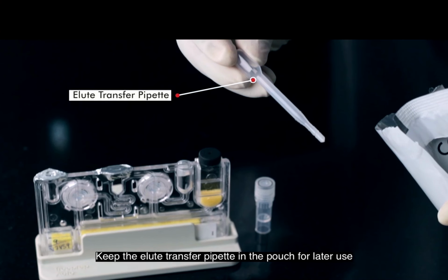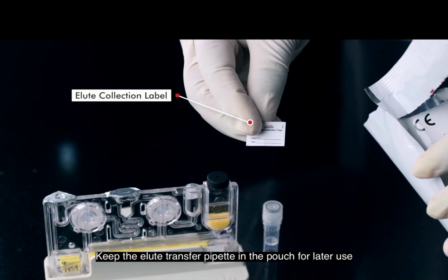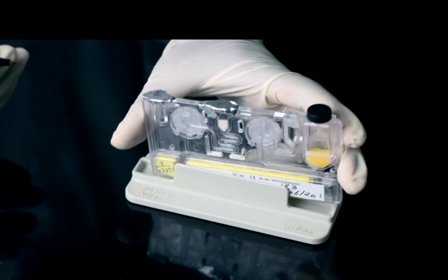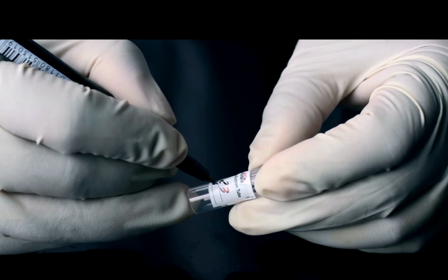So sometimes it is 2 parts. Sometimes that particular part will be inside the pouch, and you can take it and attach it. So that is at a little angle so that it is useful to pierce that particular silver foil. Then you also get a label which you can stick on the tube, okay, to write the name. But I would suggest you use a marker pen and write your ID on it. Okay. So obviously first label the cartridge, and label your eluate tube also.